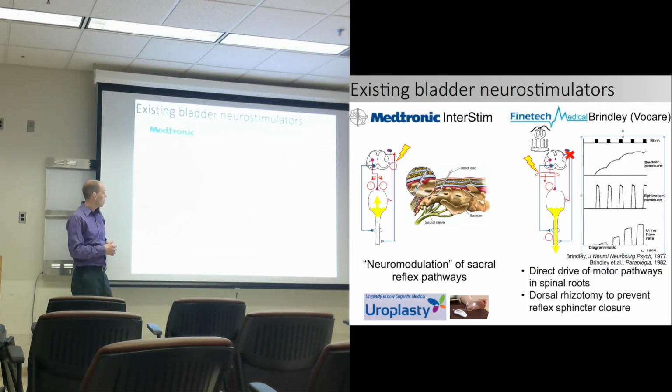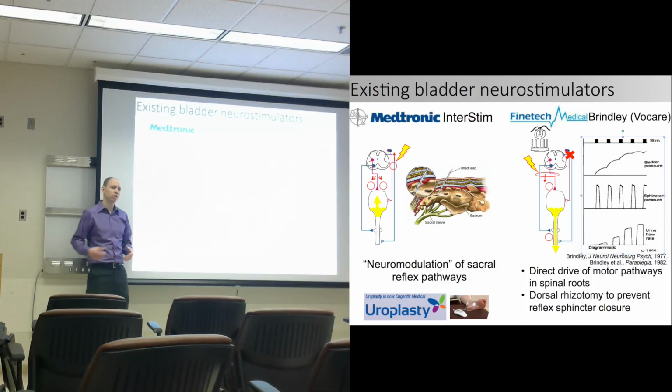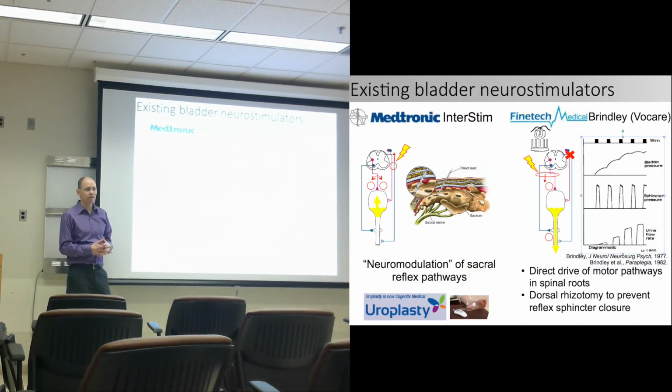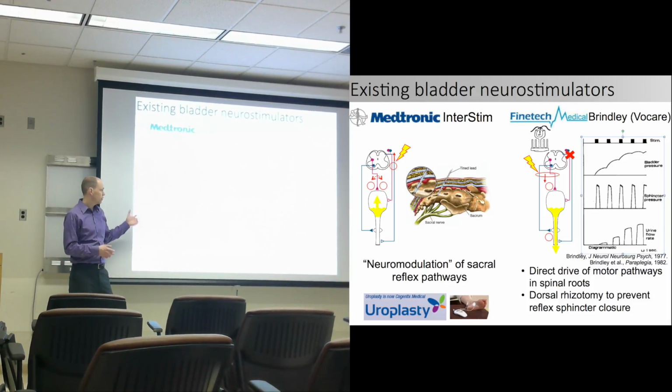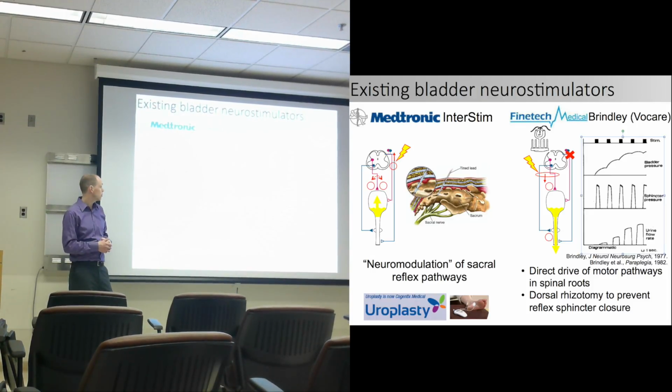a day. And you often will have a temporary trial placement where it's going to have a percutaneous lead for a few weeks. And if that's successful, like obtaining that 50% improvement, it'll get made permanent. Even then, the individuals who are first screened to those who see success can range from anywhere up to 30 to 75%. Somewhere there's a success rate to be reported.